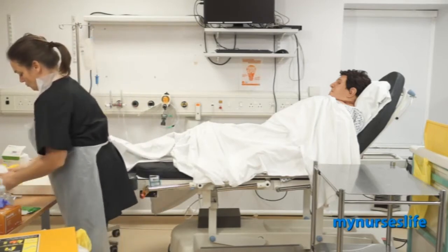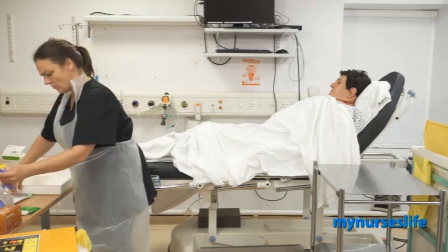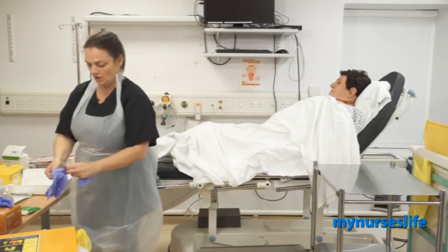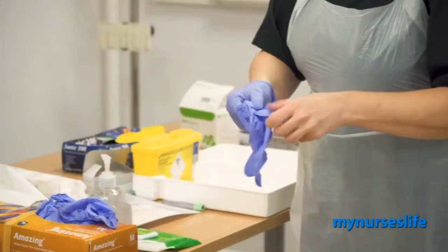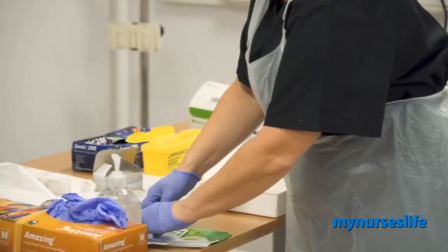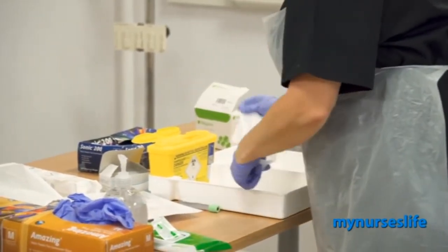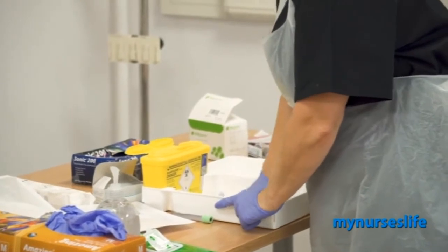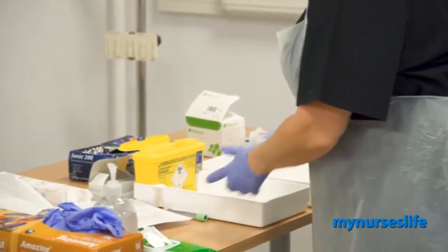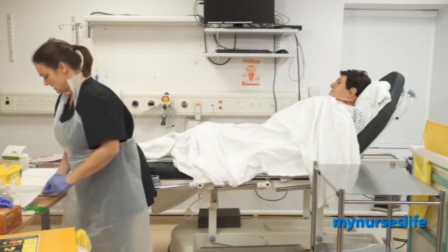So here's the drug Emma told me about, glargine. Before I prepare it, I'm just going to give the tray a wipe with alcohol wipes. Okay, and that'll just go in her domestic waste. And I need to get the drug ready.